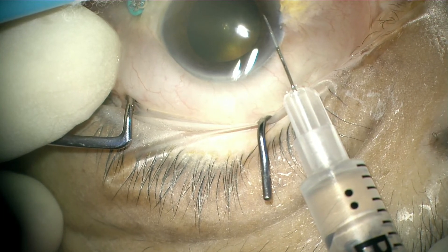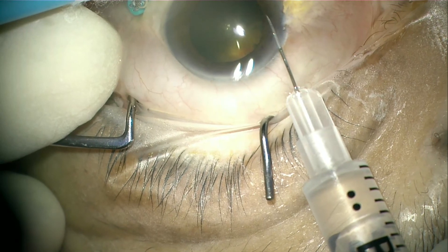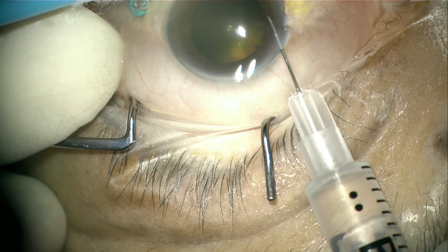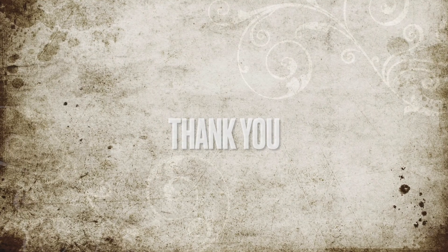Once we have aspirated the required amount of aqueous, the needle is removed and the wound is observed for any leaking. Leaking is rare with a 27 gauge or 30 gauge needle. Moreover, the corneal wound is made long, as in this case.